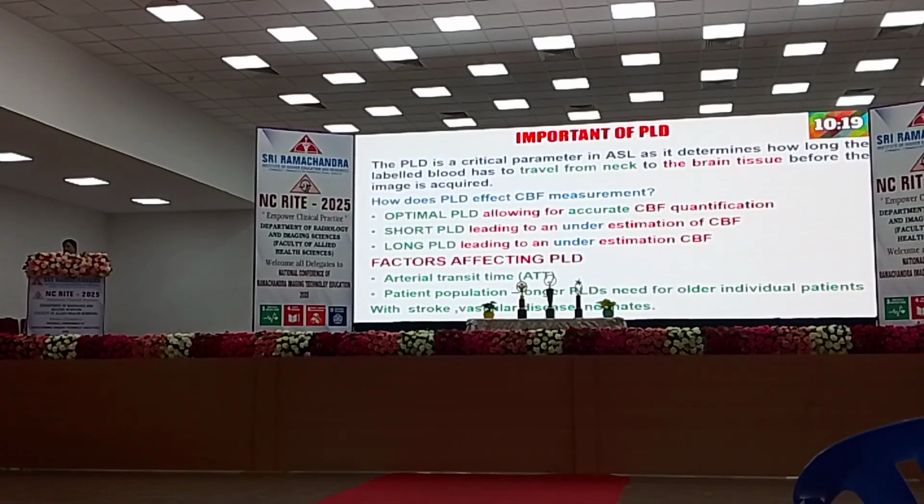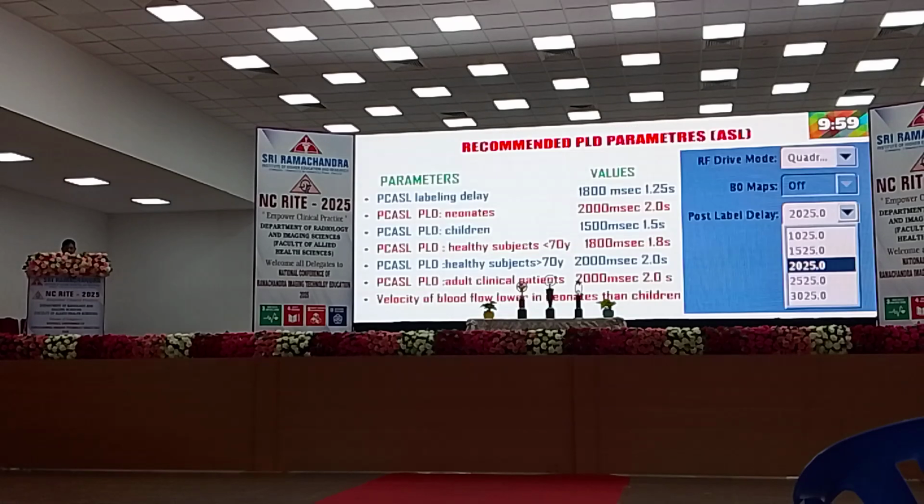The importance of the PLD is that the optimal PLD allows accurate CBF quantification. Too short or too long leads to an underestimate of CBF. The factors affecting PLD are arterial transit time and patient populations. Longer PLDs are needed for older patients, patients with stroke or vascular disease, and neonates.